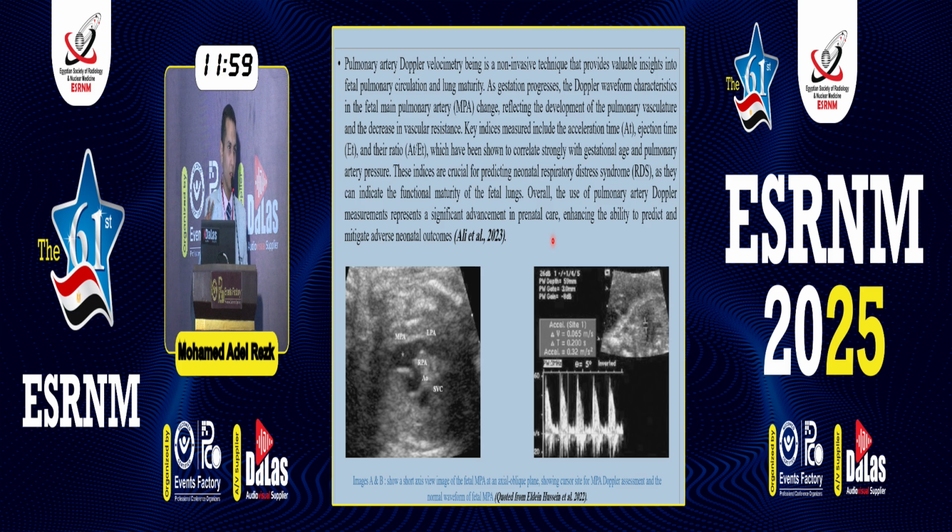The second item is to measure the pulmonary artery Doppler indices. In which views do we measure the pulmonary artery Doppler and its diameter? You have two options, because as we all know the fetus can be so mean and keeps rotating, so you don't always get an optimum view. You can measure the pulmonary artery in the axial view, or in the RVOT, which is sagittal, or even a slightly parasagittal view.